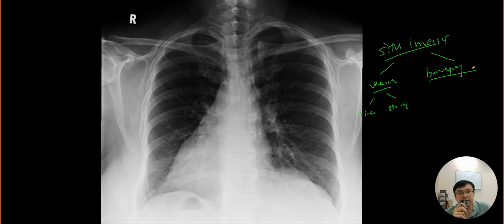Another one we will call the bronchopulmonary situs, which is the anatomical relationship between the bronchus as well as the pulmonary artery. So we draw the trachea out, right main stem bronchus, left main stem bronchus, okay? And then the pulmonary artery on the right side is inferior to the bronchus, and on the left side is above it, okay? So it's opposite in the anatomical relationship on both sides.